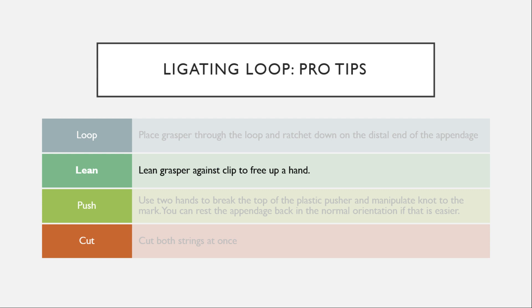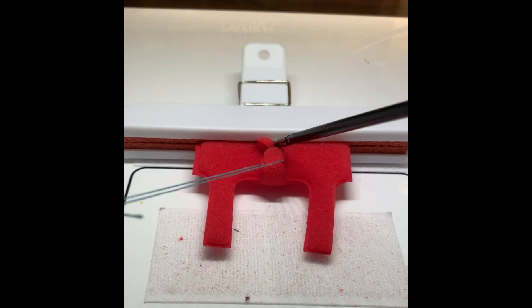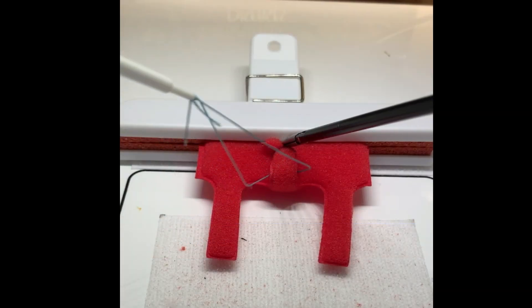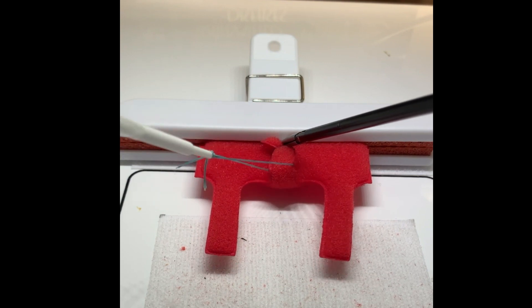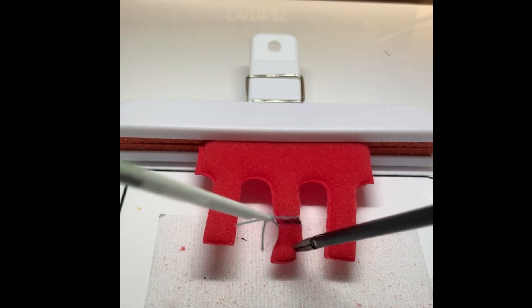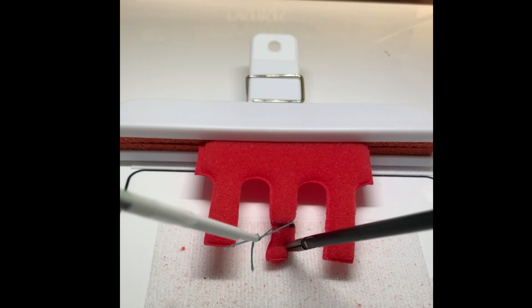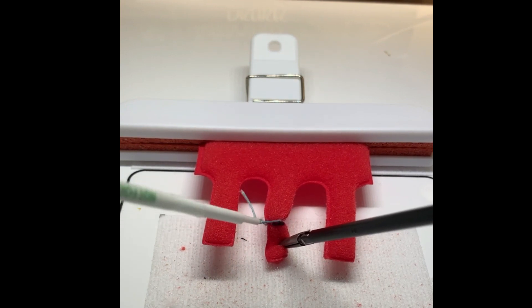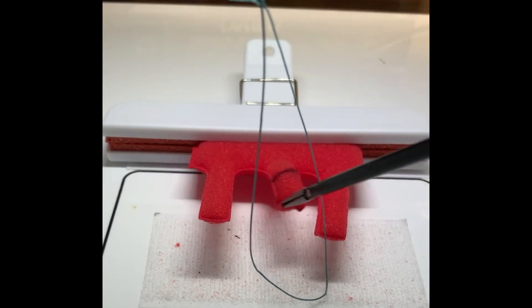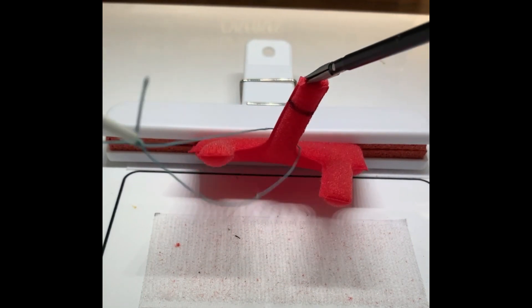Next, you can lean a grasper against the clip to free up a hand. Use your two hands to break the top of the plastic pusher and manipulate the knot to the mark. You can rest the appendage back in the normal orientation if that is easier. I like to push the knot down a majority of the way, then rest the appendage back down and manipulate the knot to the mark. This example shows how to manipulate the knot down without resting the grasper on the clip.